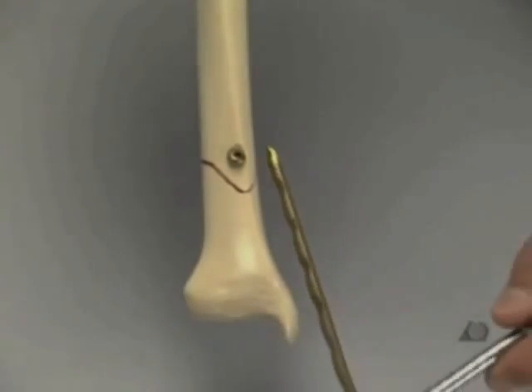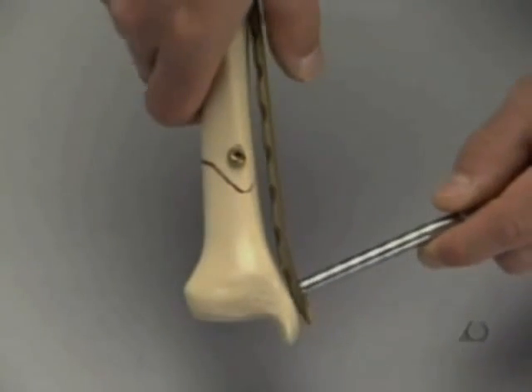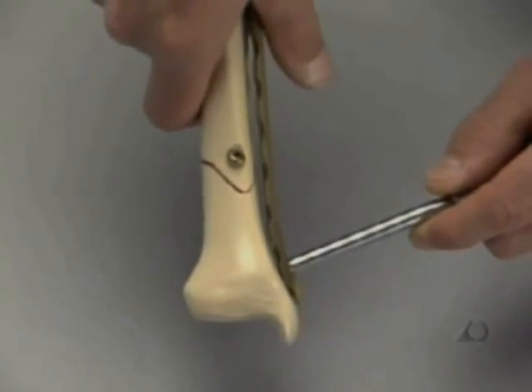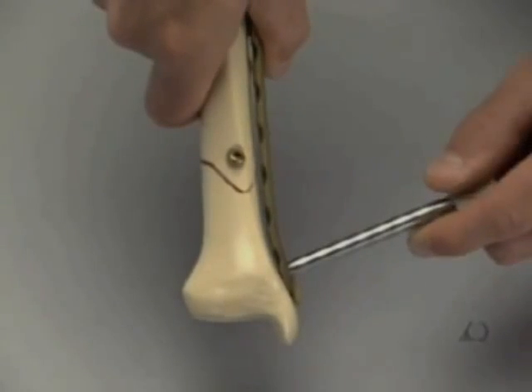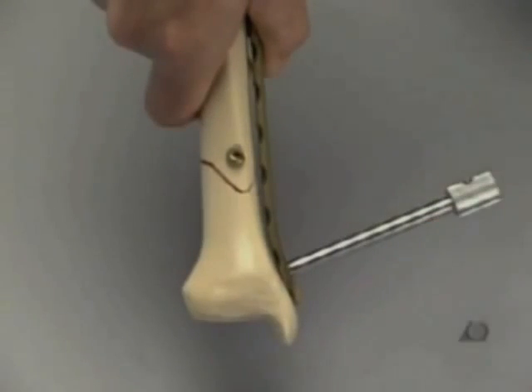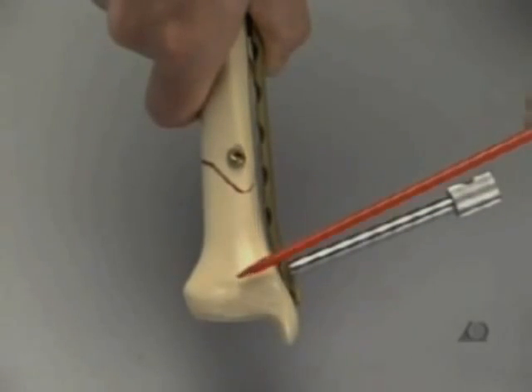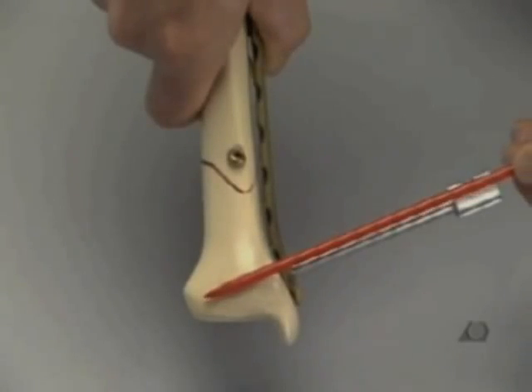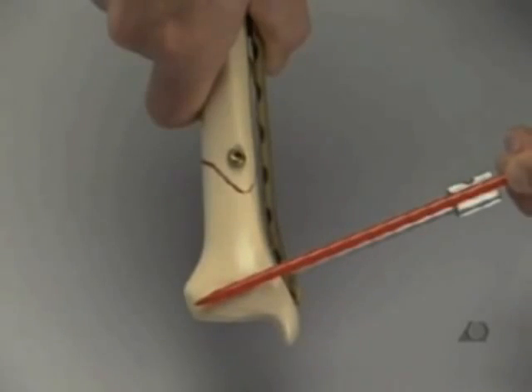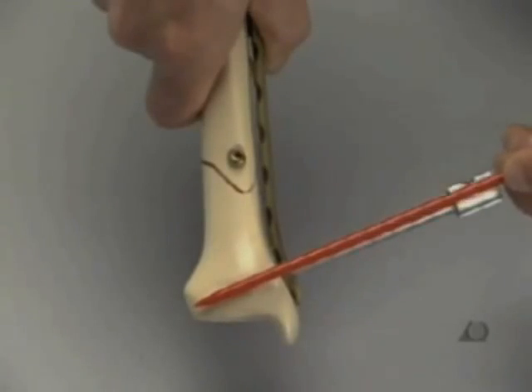The plate with the LCP drill sleeve screwed into the most distal hole as a handle is gently inserted and slid along the medial aspect of the tibia. As the locking head screws cannot be angled, care must be taken when positioning the plate to prevent screw penetration of the joint.